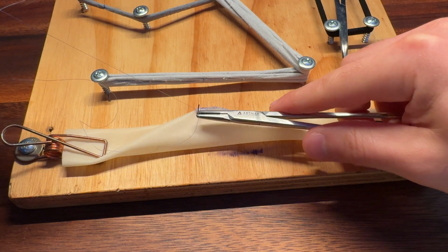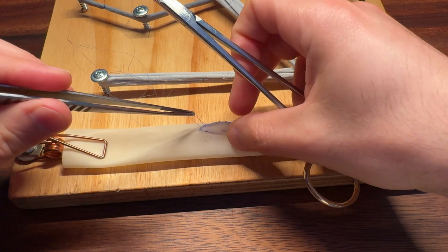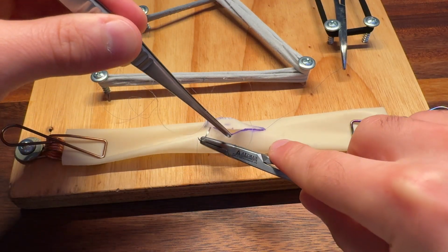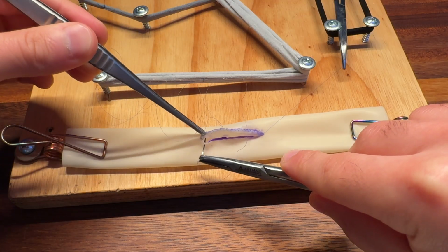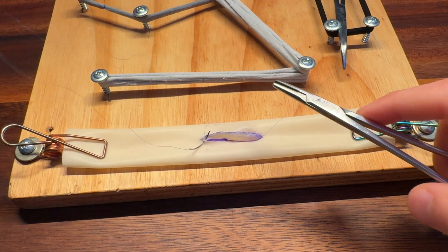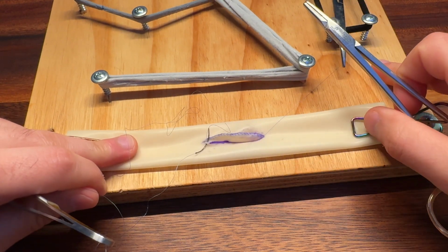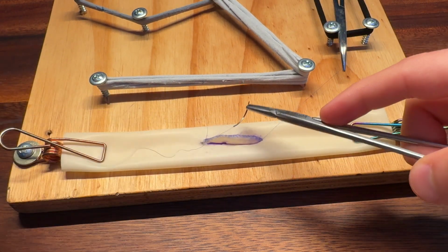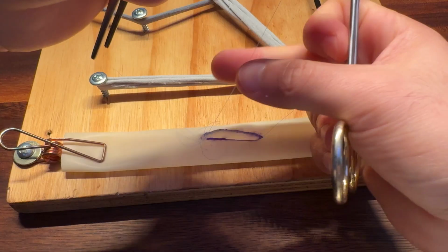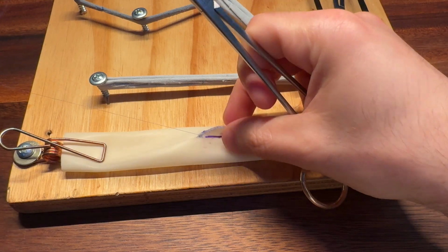So a little bit of traction. There's a little bit of traction there to help me. And then come out. Make sure I'm not crossing over. Pull out the suture and try to reload close to the incision for efficiency. And there you go. So I'm just going to follow this pattern all the way down, okay?